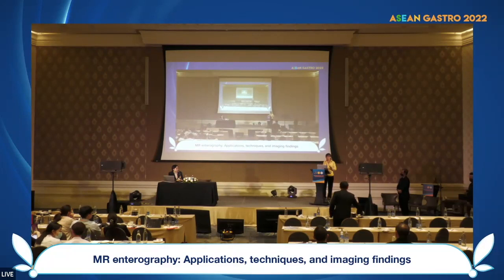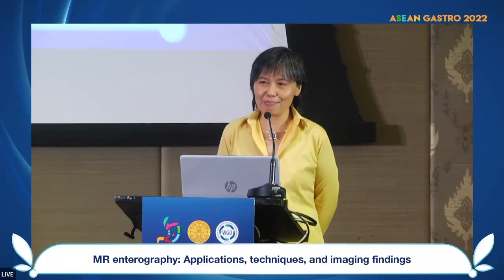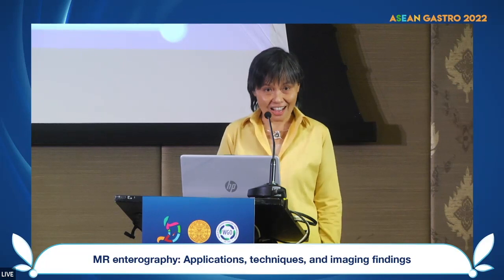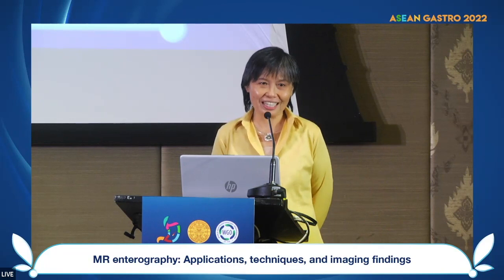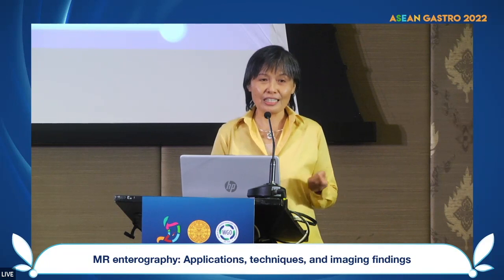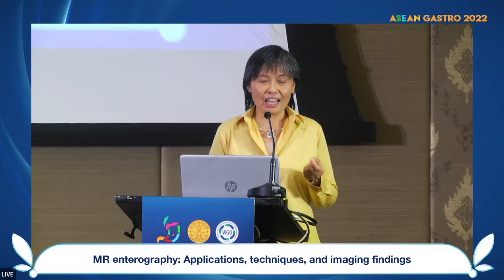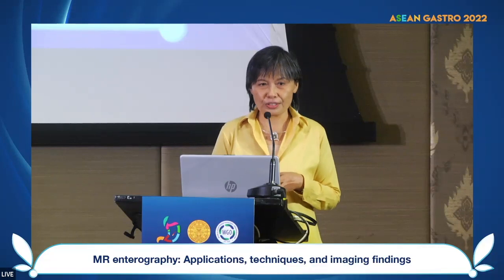Yeah, CT enterography is also a very good tool. It's easy to do, it's fast, and the images are easier to interpret. And I would say that if the patient is not young, and you just do it once or twice in their lifetime, you go for CT enterography. But in Crohn's disease, the kids are sometimes 12, 13, 14, or even early 20s, and you have to do it every 3 months, 6 months, a lot of radiation if you perform CT. So that's why MR enterography has a role in Crohn's disease.